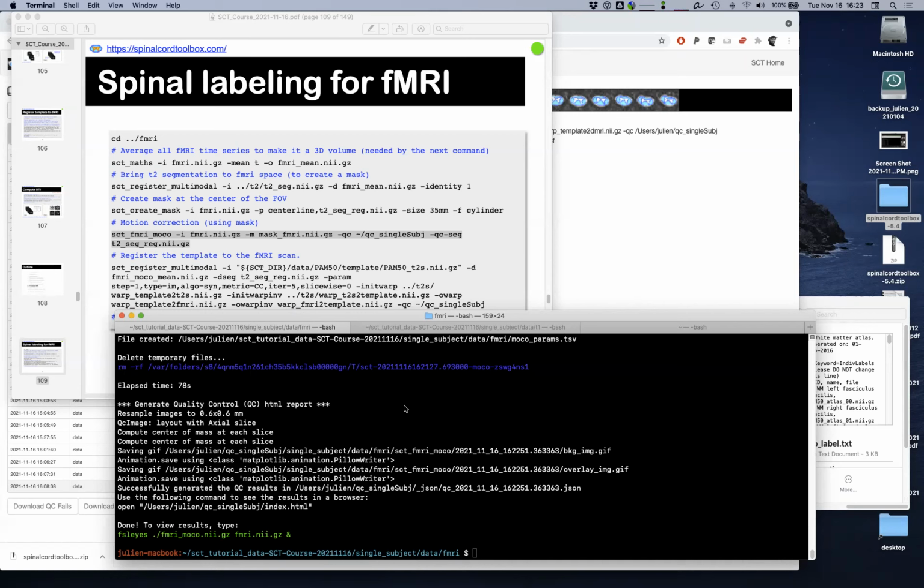You're right. This is not something you can trust in an automatic fashion. You could almost do a stepwise registration. In the first step, you have a very big mask that will take care of the coarse motions, and then in step number two, you can take a smaller mask. So you can do it in a hierarchical way and reduce the mask, and maybe you can come up with a method to automatically find the right size, something like zooming down.